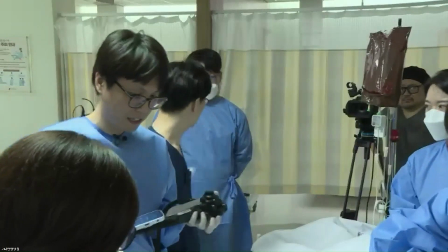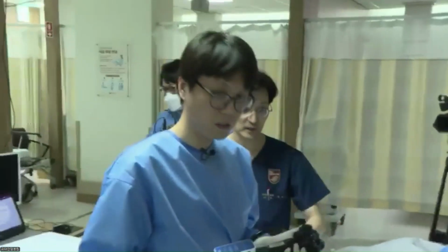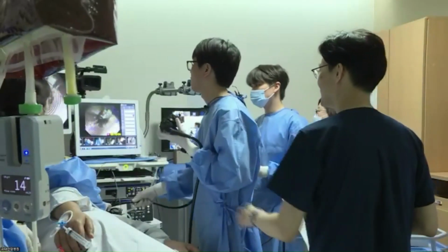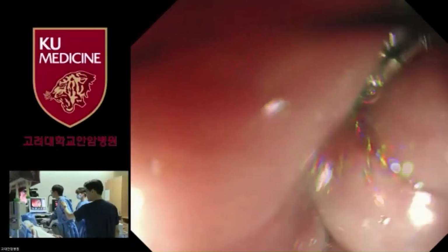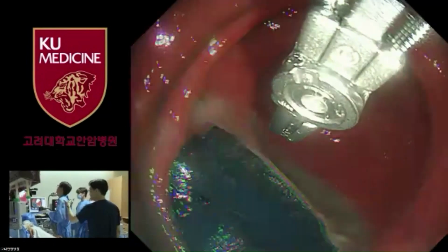Also I wanted to say hello to the robotic hands. Hello. And we have only how many minutes? 1 minute. I'm so sorry. In this case, we cannot show you the navigation, but this is the way of insertion through the overtube. Even though the device has a horn at the arm, you can see the insertion is quite safe.